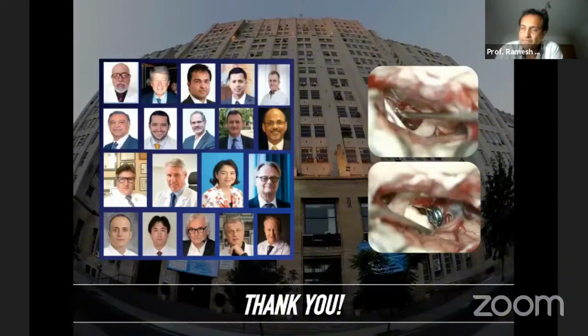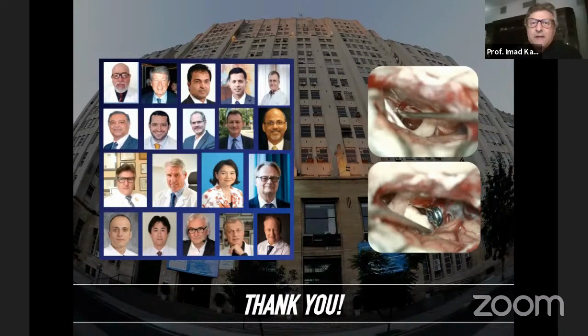I think it's an important point when you go, as you mentioned, lateral to the supraorbital nerve. The chance to enter the sinus is remote unless you have an opera singer that has big sinuses. But being lateral to that nerve, the chances will be less. We have published about 20 years ago 16 cases using this technique, and we used it even for suprasellar tumor, but we added taking the rim of the orbit as we are doing a mini frontoorbitozygomatic, and we put it back. But thanks to Dr. Pernensky, who has introduced this subject.